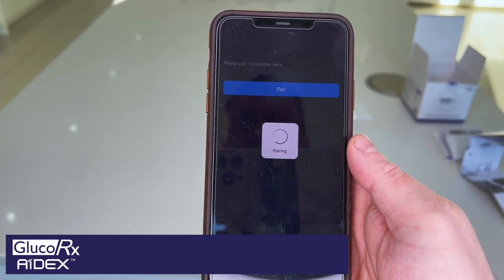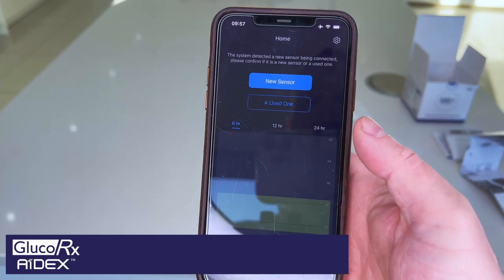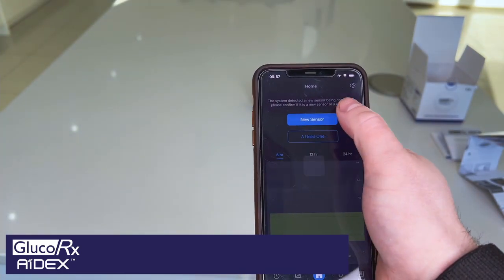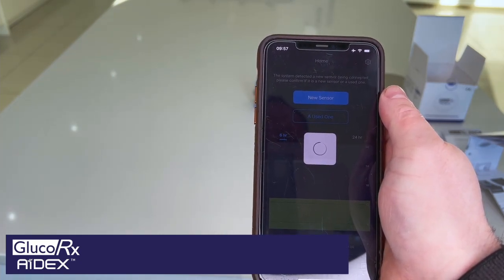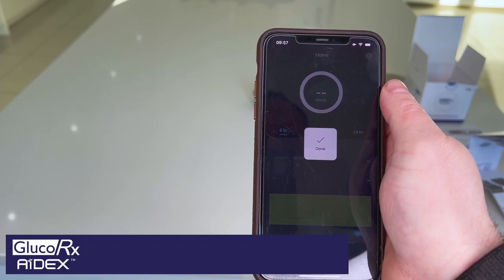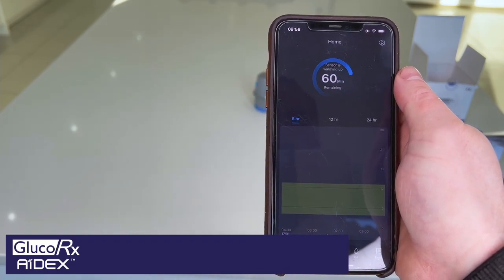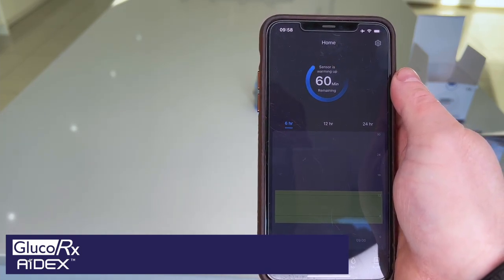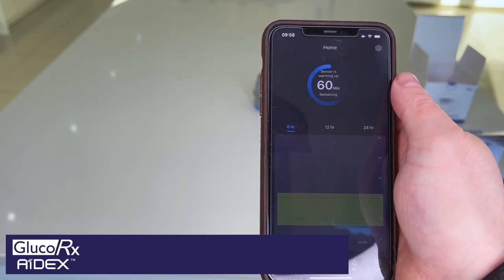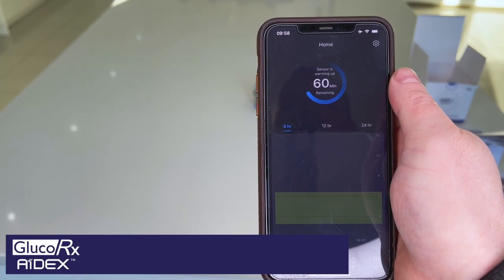This will now pair the transmitter to the smartphone. The pairing is done — it is a new sensor, which has now been done. So now this is the normal 60-minute warm-up. It's going to warm up for the next 60 minutes, after which time I'll start to get my glucose coming through every five minutes. As simple as that.